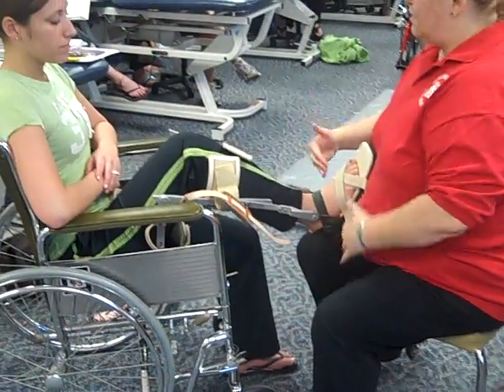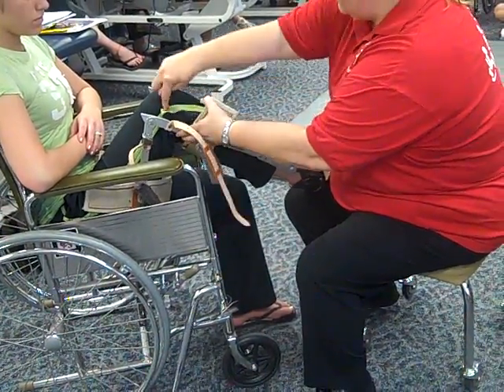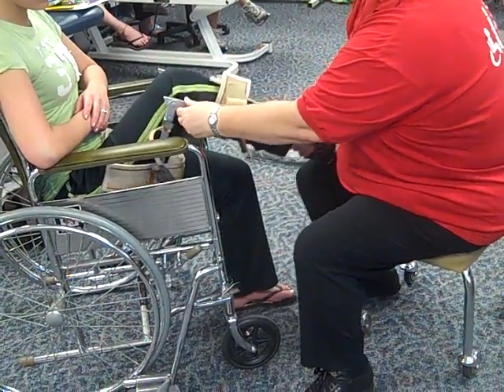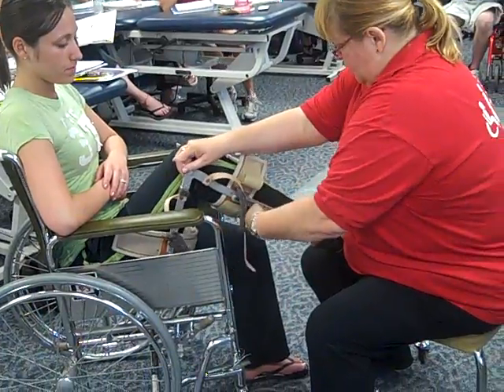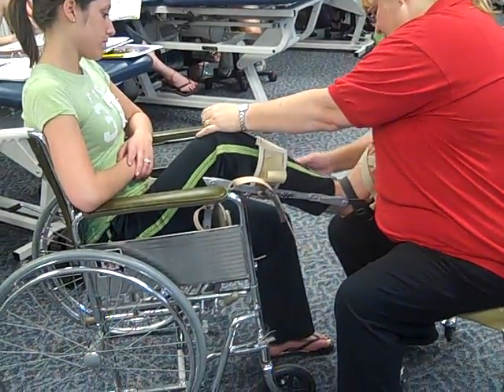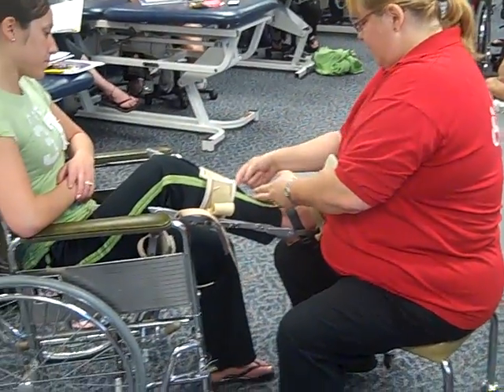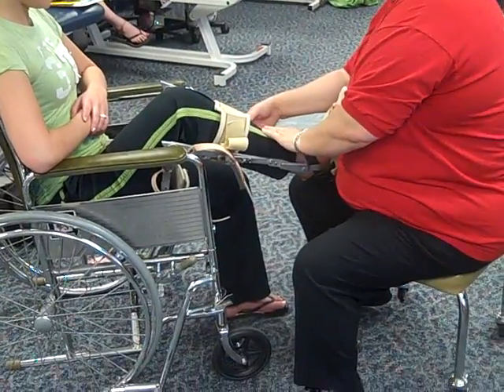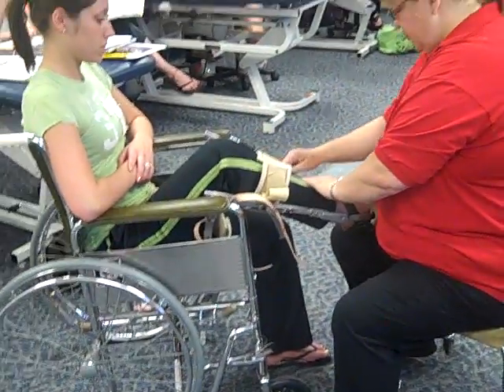Next thing I'm going to do is adjust the height of the knee angle. Right now the center of her knee motion is way down here, so it's going to need to be shorter. That looks pretty good. Once I get that where I want it, I'm going to tighten that down — righty tighty. This one is separate so I have to come over here and shorten it a bit. What I would have to do here — this is set up for somebody taller — is take this lug nut out and move it up to another spot. You would unscrew it, take it out, move it up to another hole. So we're going to pretend for right now that that's lined up with her knee.